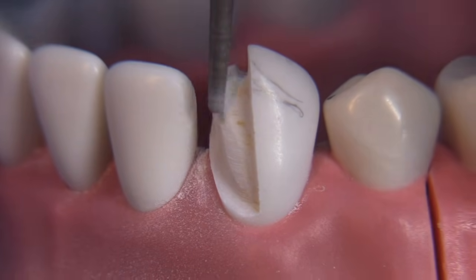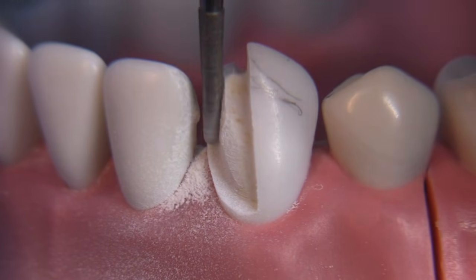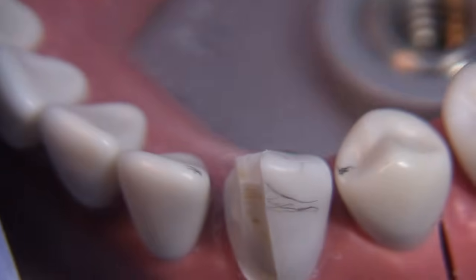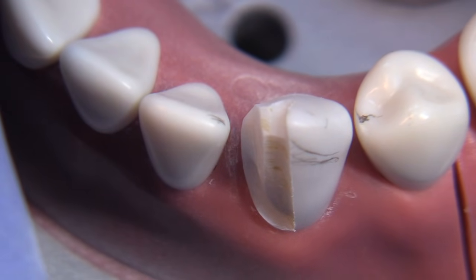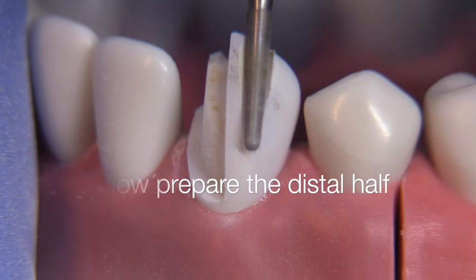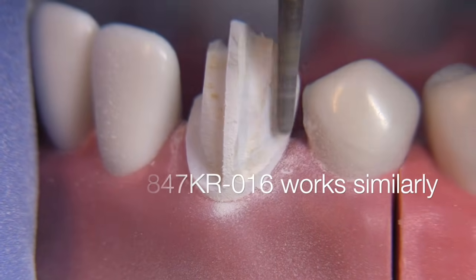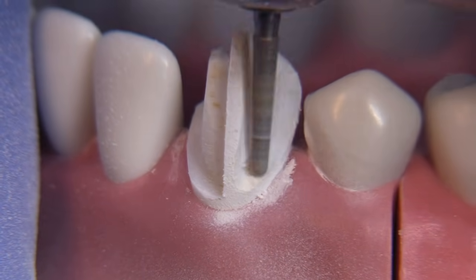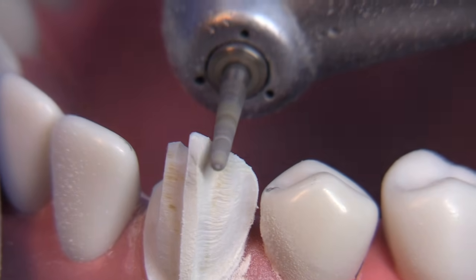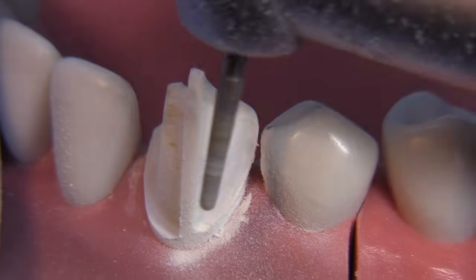I've switched to an 856 diamond, which is very similar, working from incisal down to gingival. I'm going to leave a tenon here — this is the T-prep technique. It works really well for teeth with unusual anatomy, like this canine rather than a typical central, because you can use it as a guide and take your measurements from the unprepared area. We're simply duplicating our efforts on the other side of the preparation.